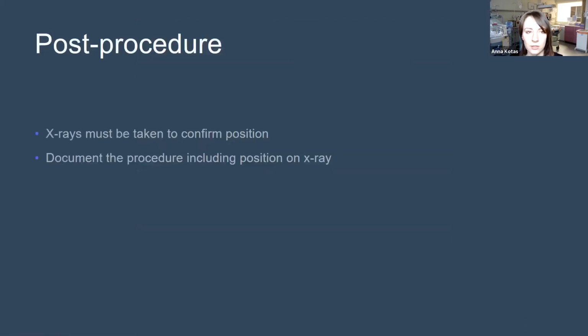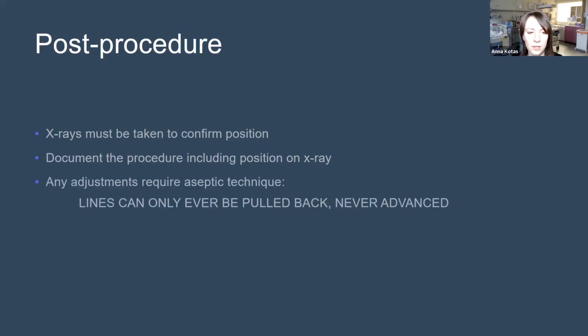Okay, so after the procedure, a few things that are needed. It's mandatory to take x-rays to confirm the position of the catheters, and you must document that the procedure has taken place, and also the location of the catheters, both at the measured length of where they insert into the cord, and also the position on the x-ray, and we'll look at some x-rays in a moment.